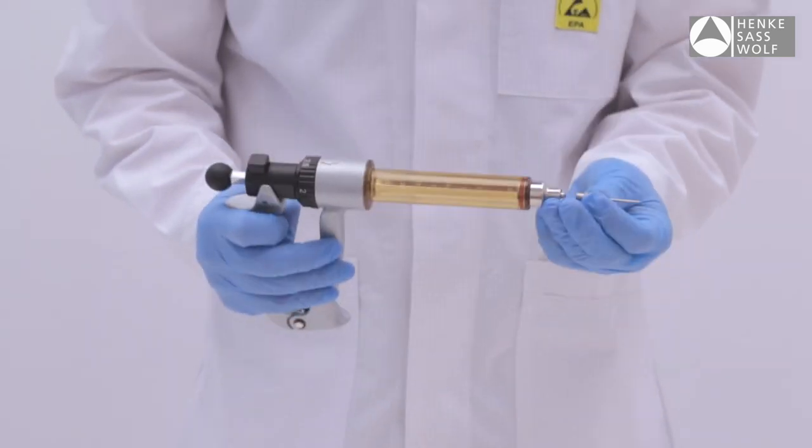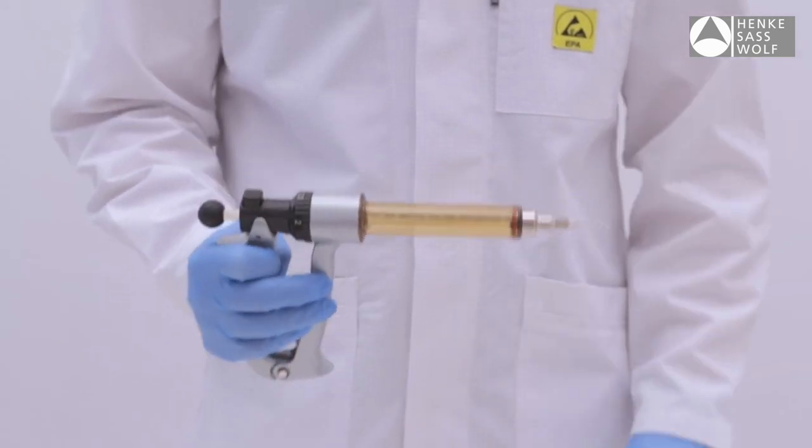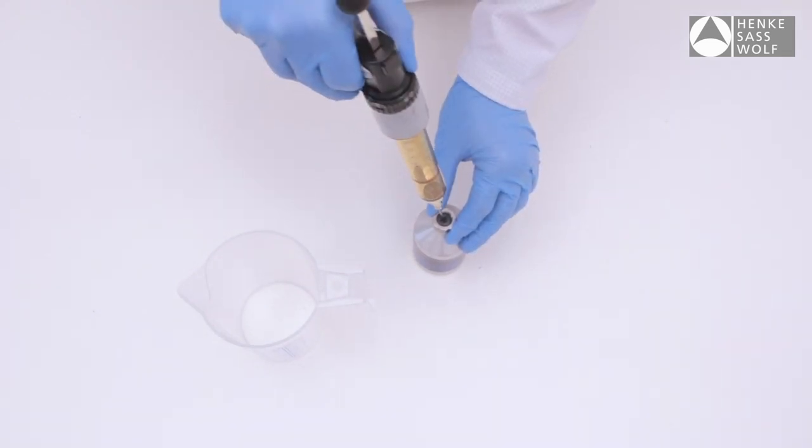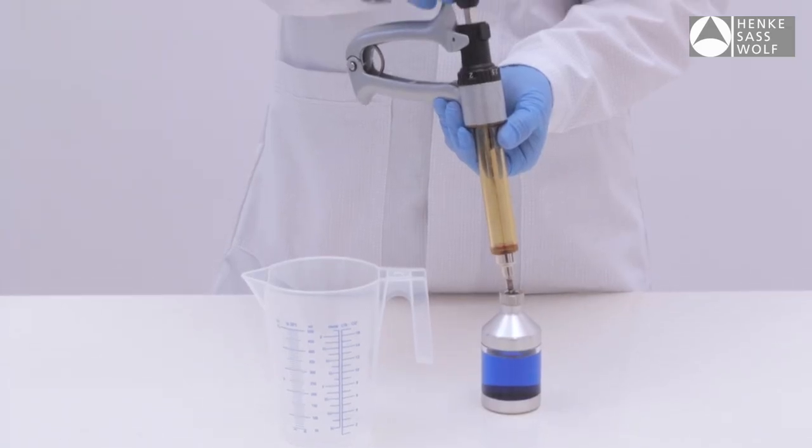Fit needle to syringe by turning the needle clockwise. Insert the needle into the rubber bung of the bottle. Pump air into bottle by pushing piston knob.